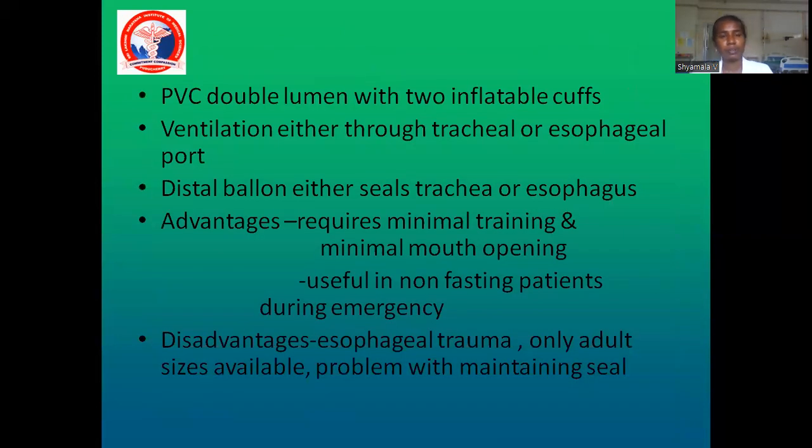It is made up of PVC, double lumen with two inflating cuffs. Usually ventilation is either through the tracheal or the esophageal port. You can ventilate through either of these. The distal balloon enters and seals the trachea or the esophagus.